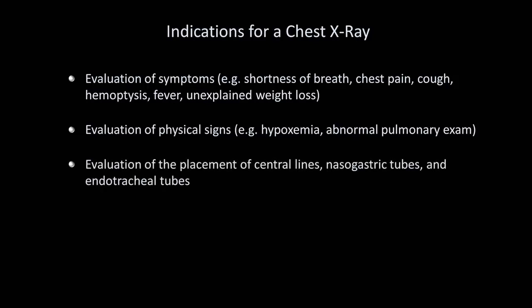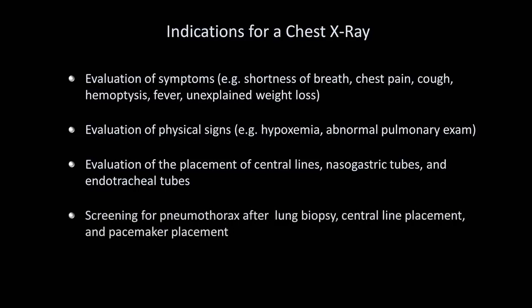Evaluation of the placement of central lines, nasogastric tubes, and endotracheal tubes. Screening for a pneumothorax, which is air in the pleural space, after lung biopsy, central line placement, and pacemaker placement. Finally, a relatively specific indication is evaluation of suspected pacemaker lead fracture.